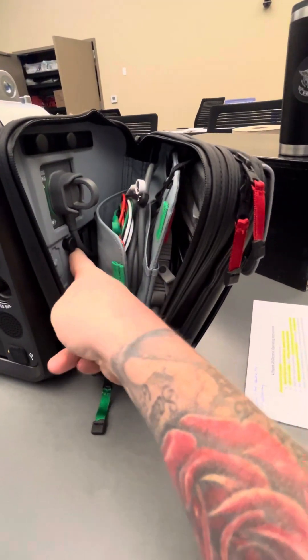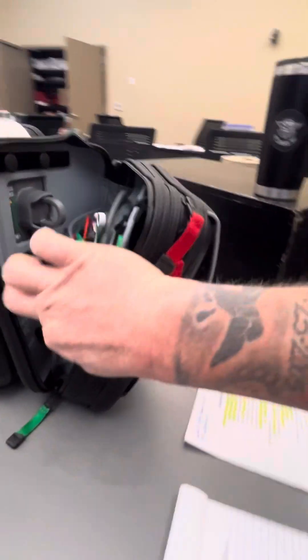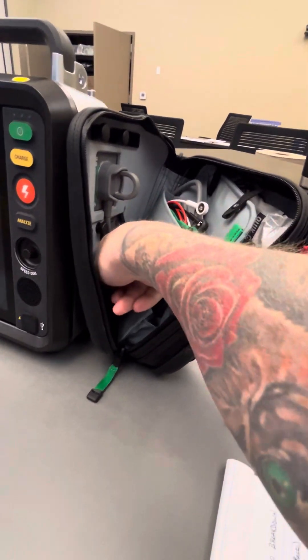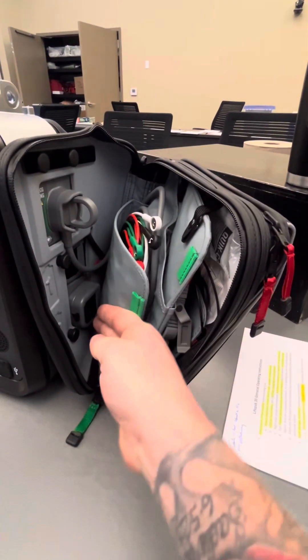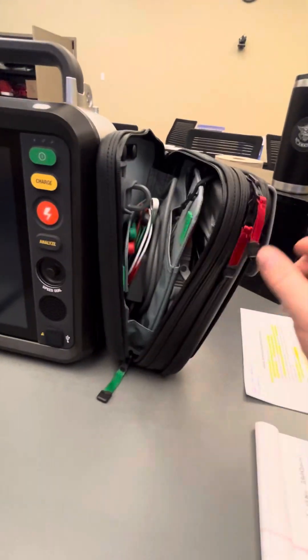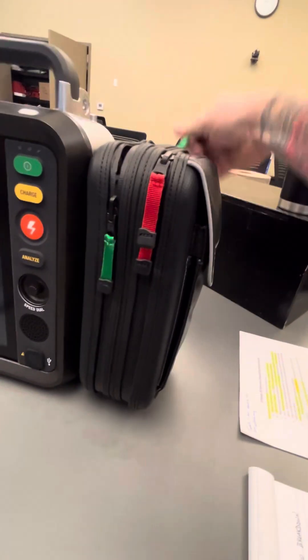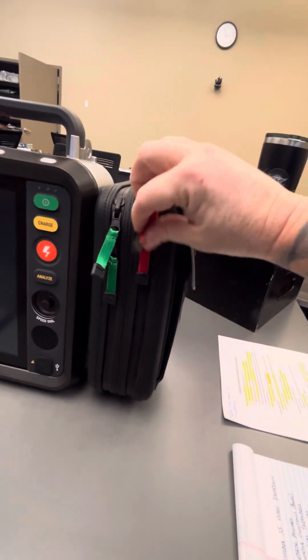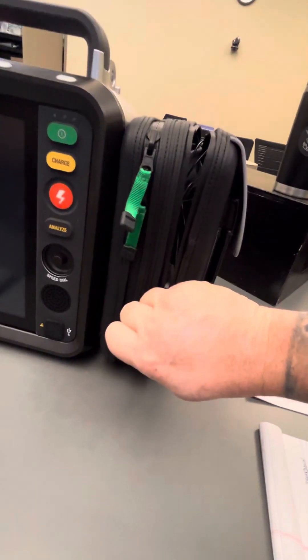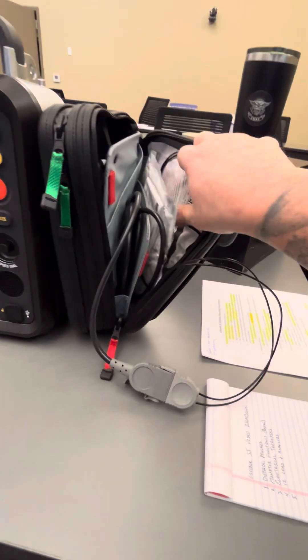You also have two batteries here. Each battery has a little black button that allows you to release and pull the batteries out, then push them back in. On the red side, this is your defibrillation cable and pads — you can think 'red is dead.' Unzip your red pouch and this is where your defibrillation cable as well as your pads are stored.